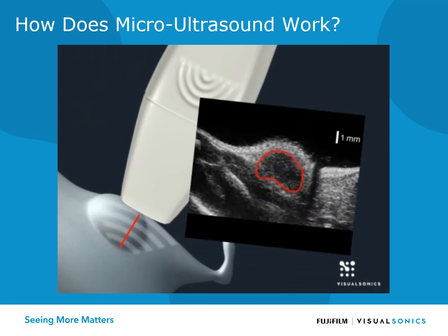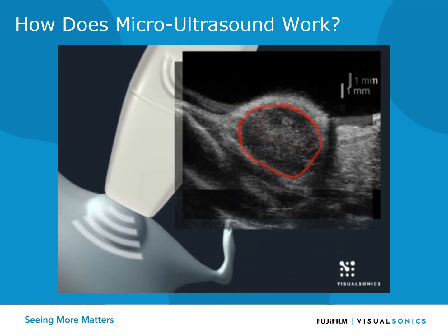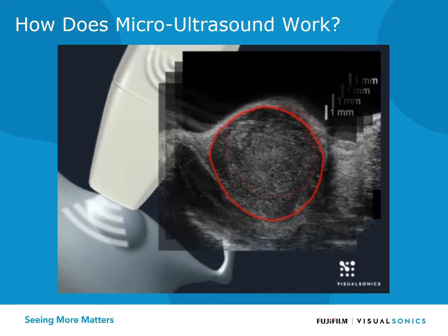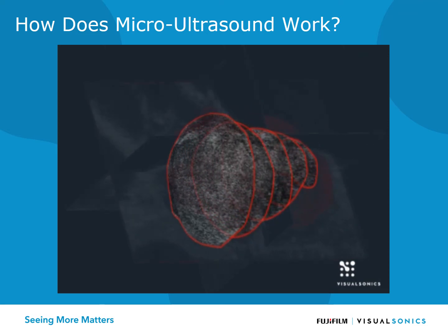So it's real time. And if you attach the transducer to its 3D motor, you can scan the tumor in a stepwise manner, and the step size can be as low as 80 micrometers. The system takes multiple slices, and at the end of the 3D scan, it stitches together all the images. And by loading the CineLoop into the 3D software, you get the 3D volume reconstruction right away.